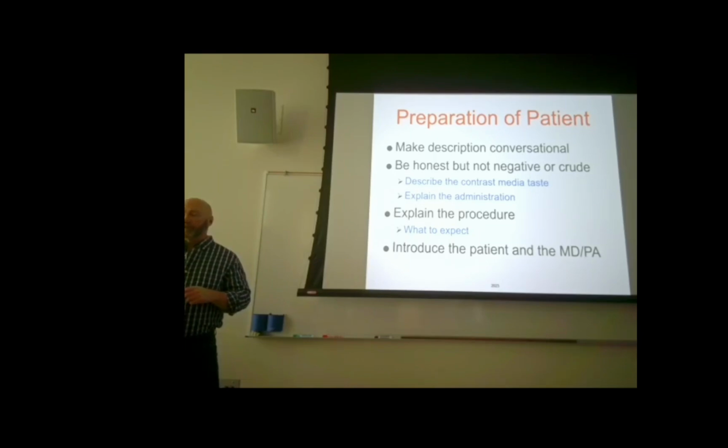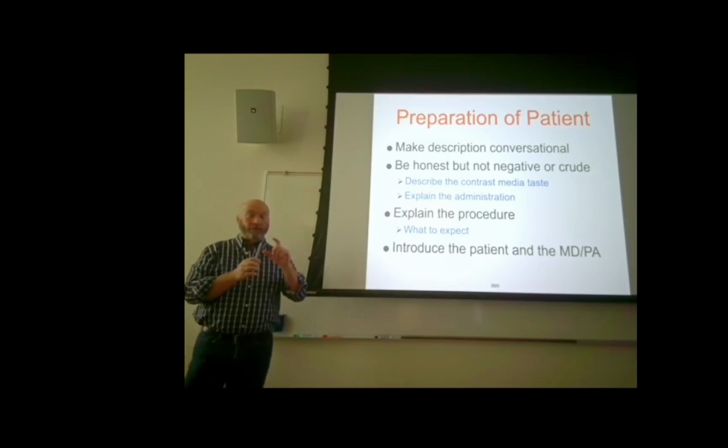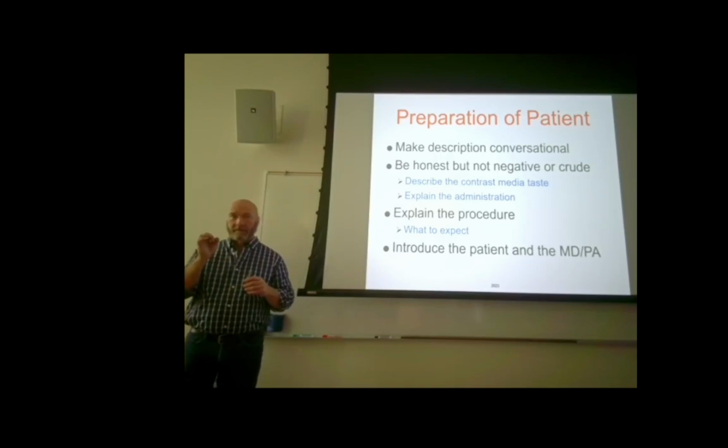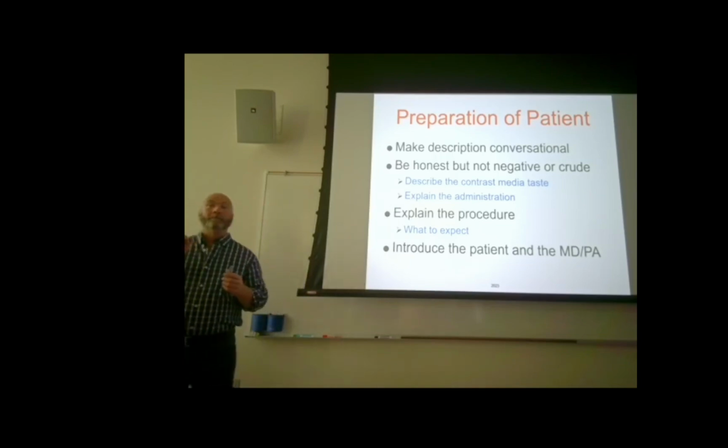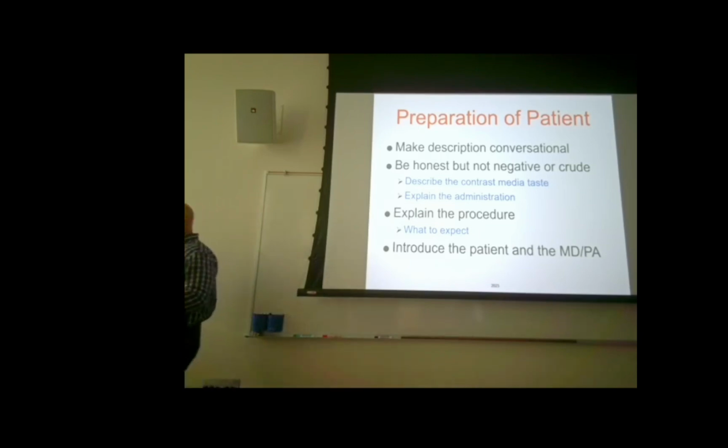If you've got a patient who's got, you're gonna have to do an iodinated small bowel series, break one of those things out. You can bypass most of the taste buds by giving them one of those and just having them suck through that great big thick straw as opposed to those little bitty skinny straws, okay? Much, much easier to get the patient to drink them out of those as opposed to the little bendy straws.